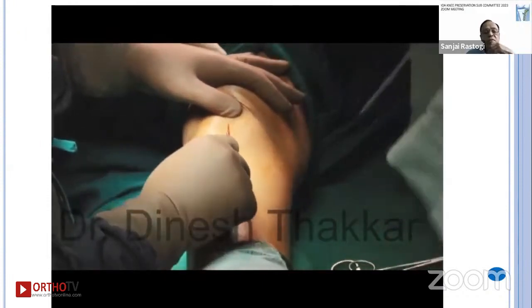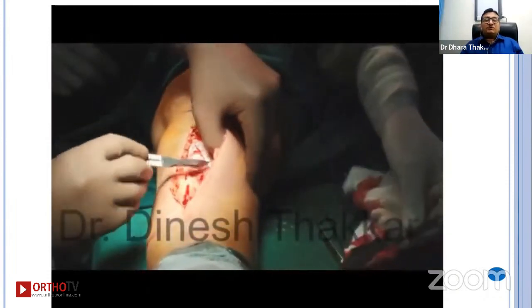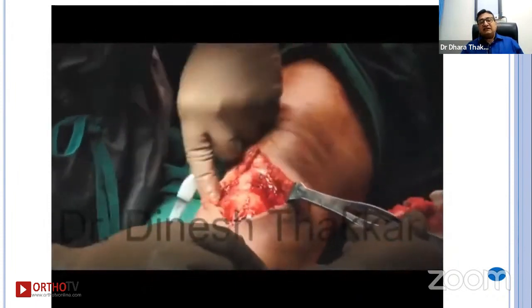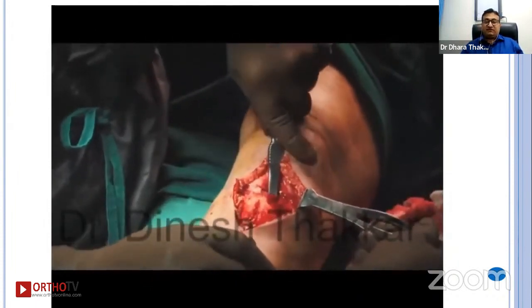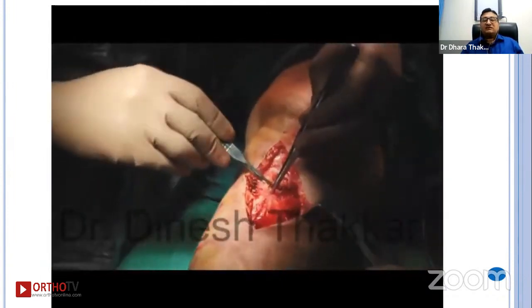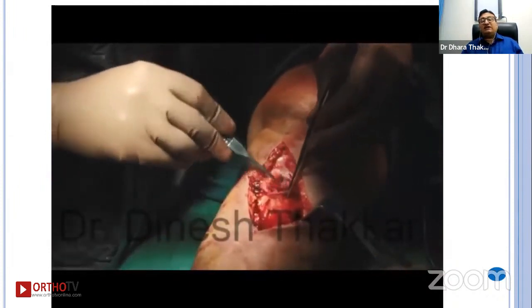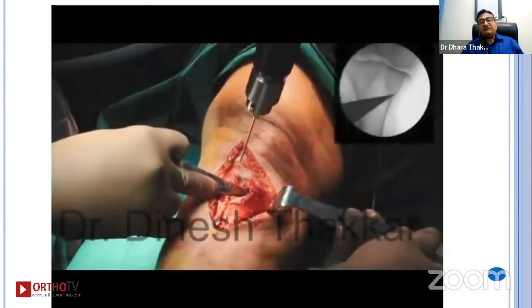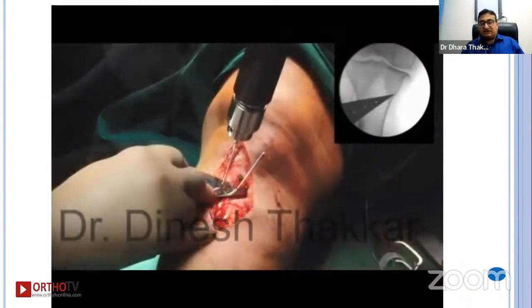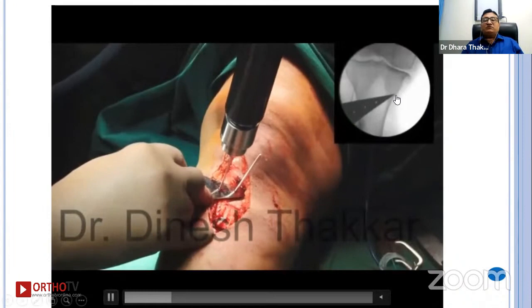Okay, this is the incision; a midline incision is being made. The proximal tibia is being exposed, and then the periosteum is elevated from the area where the wedge is to be removed. This is the periosteum I am elevating from the proximal tibia, from where we have to remove the wedge. Then I fix this, it must be 12 degrees or whatever the required wedge is. Here we can see that the apex is exactly at the medial border of the tibia.